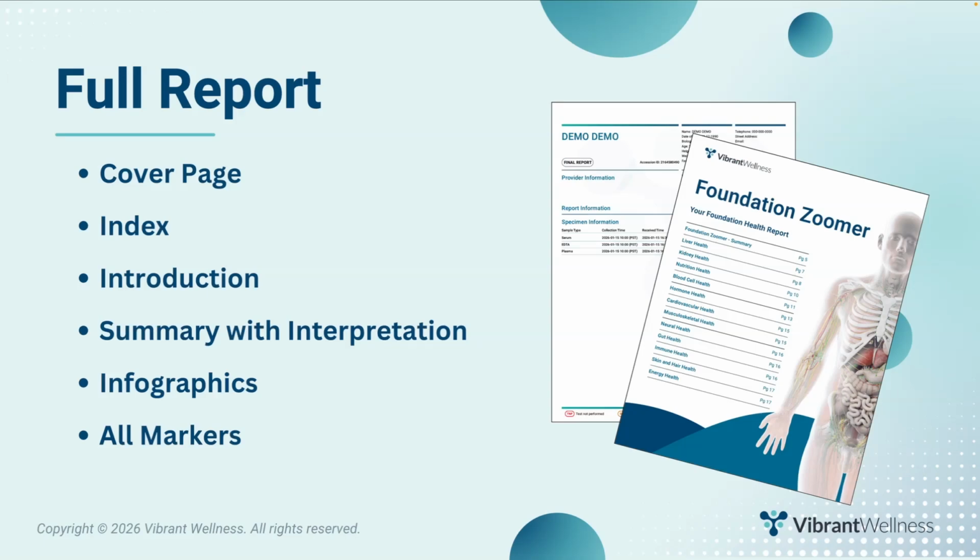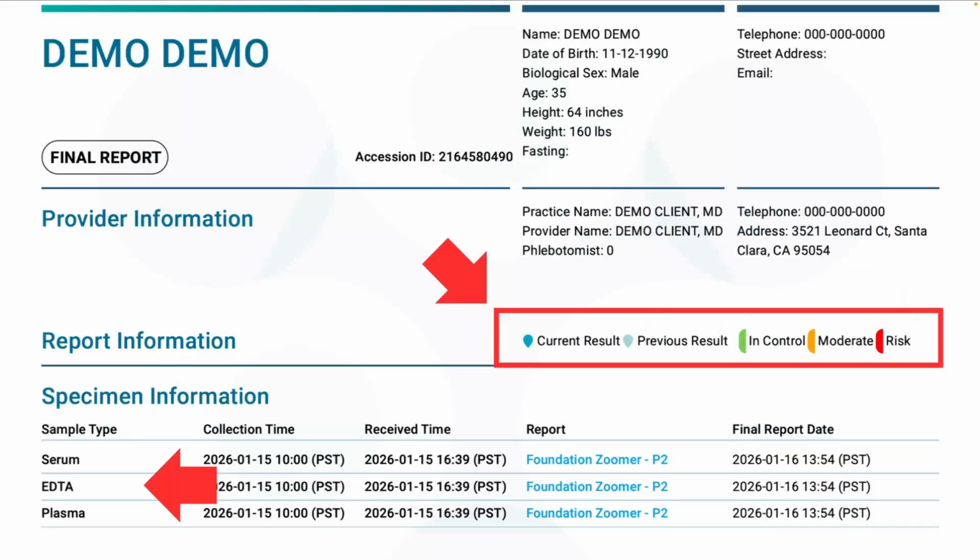Let's start with a quick overview. The Foundation Zoomer report includes a cover page, an index, an introduction, a summary with marker interpretation, including educational infographics, then ends with a list of all the markers. Let's dive in. The cover page identifies the sample type and includes the results interpretation key.